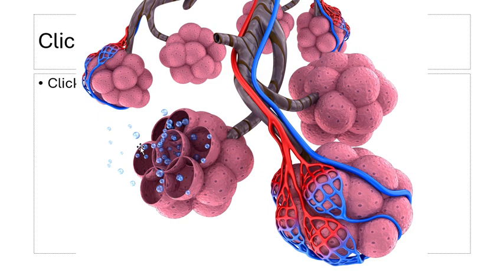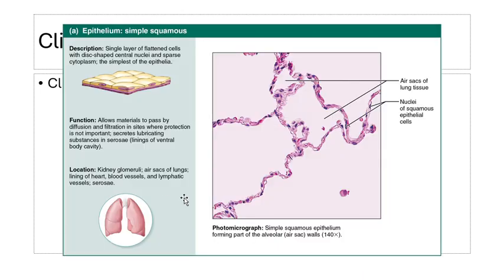For example, here is our alveolar sac. And if we make a section here, we can see just some empty circles, like here. This empty circle represents our alveolus that's surrounded by one layer of flattened cells. This flattened cell is called simple squamous. So what is its epithelium? This epithelium is called simple squamous. Where can I find it? At the lungs, at the alveolus of lungs.